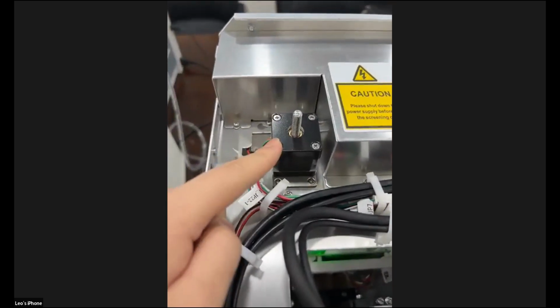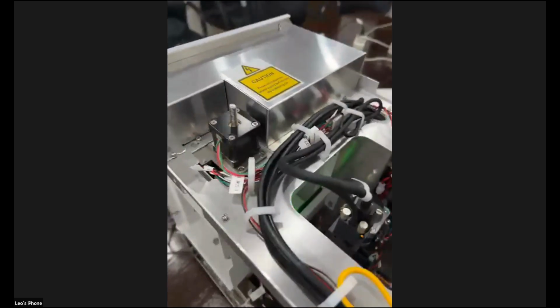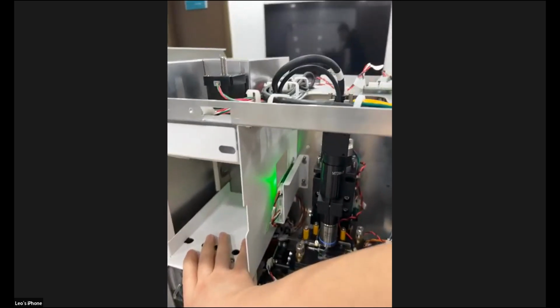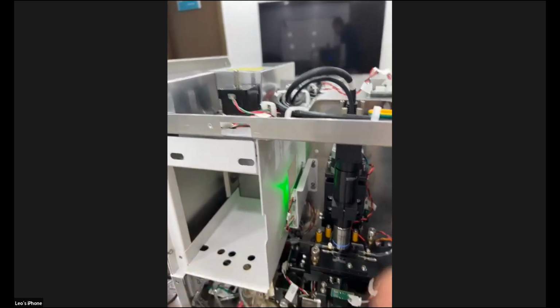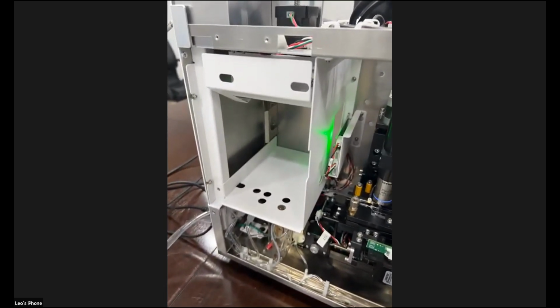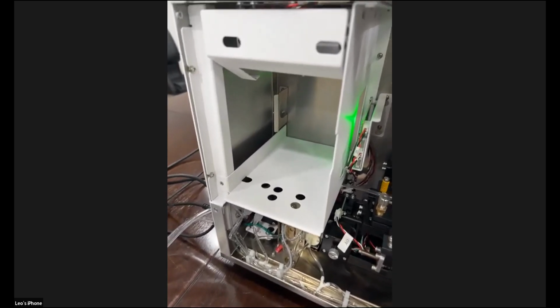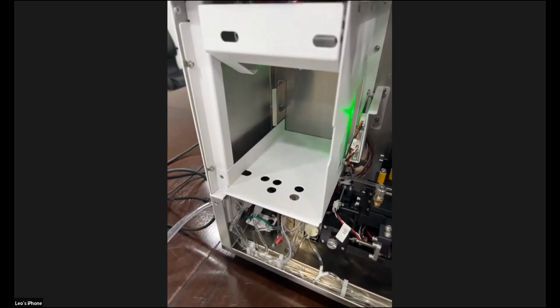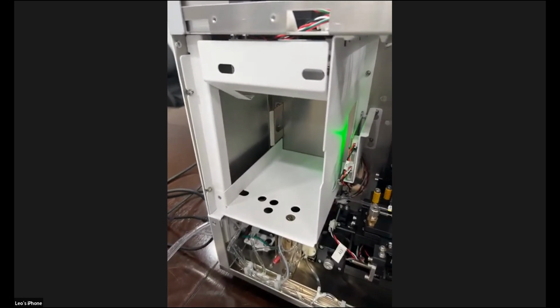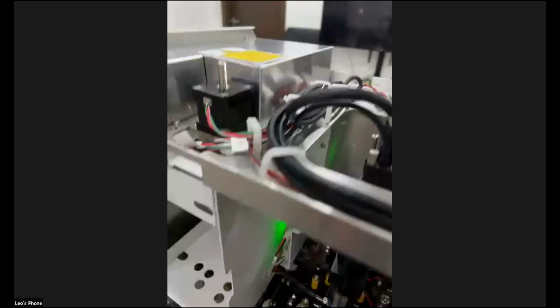And also there's a small motor. Actually, this small motor is to control that. You can see from the left side, there's a special space that we can use for the internal reagent. We can place a small bottle into this space, and this space contains the reagent bottle, especially for the detergent A. So this motor is to control that.